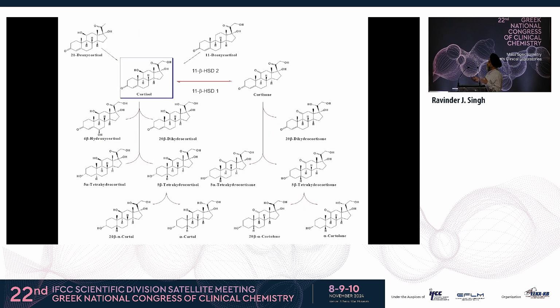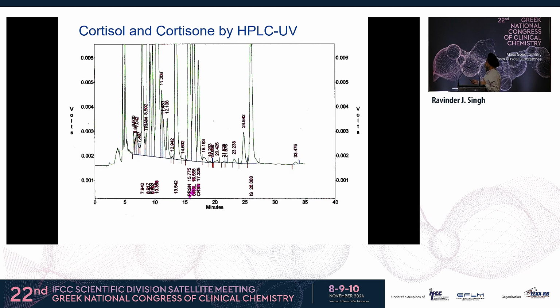And the deeper you go, the more you find those various compounds which can cross-react with the antibodies. So this is just an example here. If you take a sample and the immunoassay result, the doctor doesn't like it, you run it by HPLC, most of the samples will be okay. But this was the area here, cortisol and cortisone, and on this sample it was still very complicated. So our technologists were not very happy calling this result.